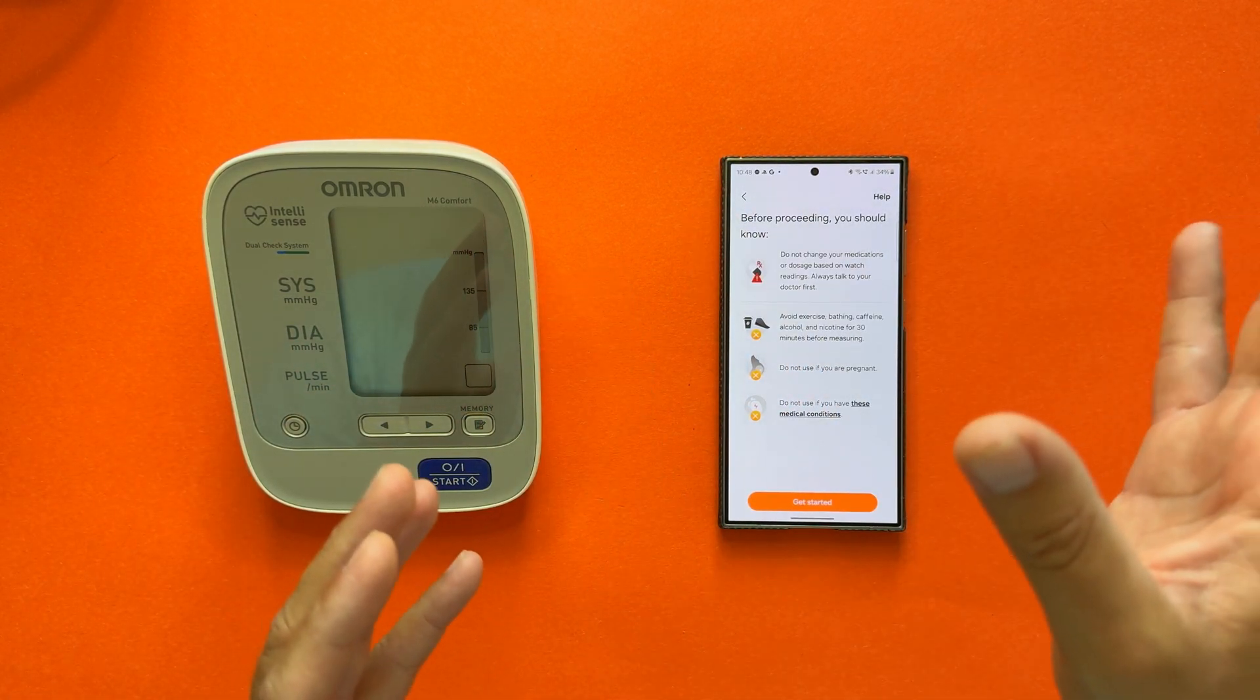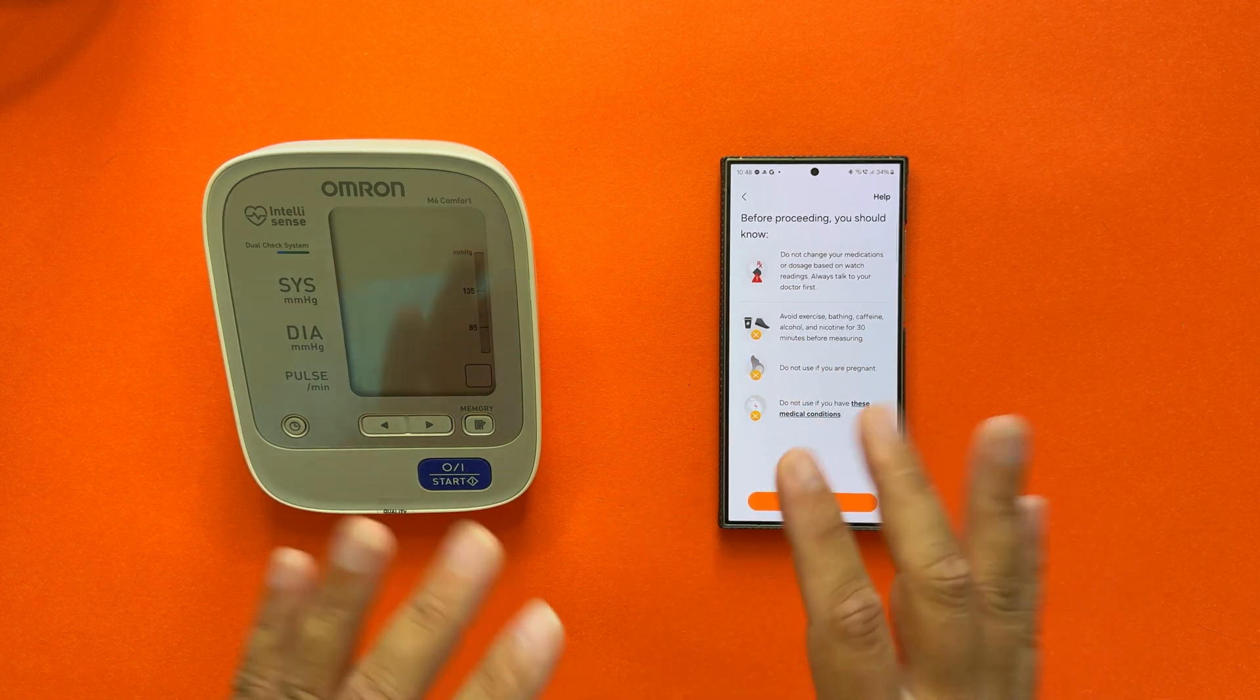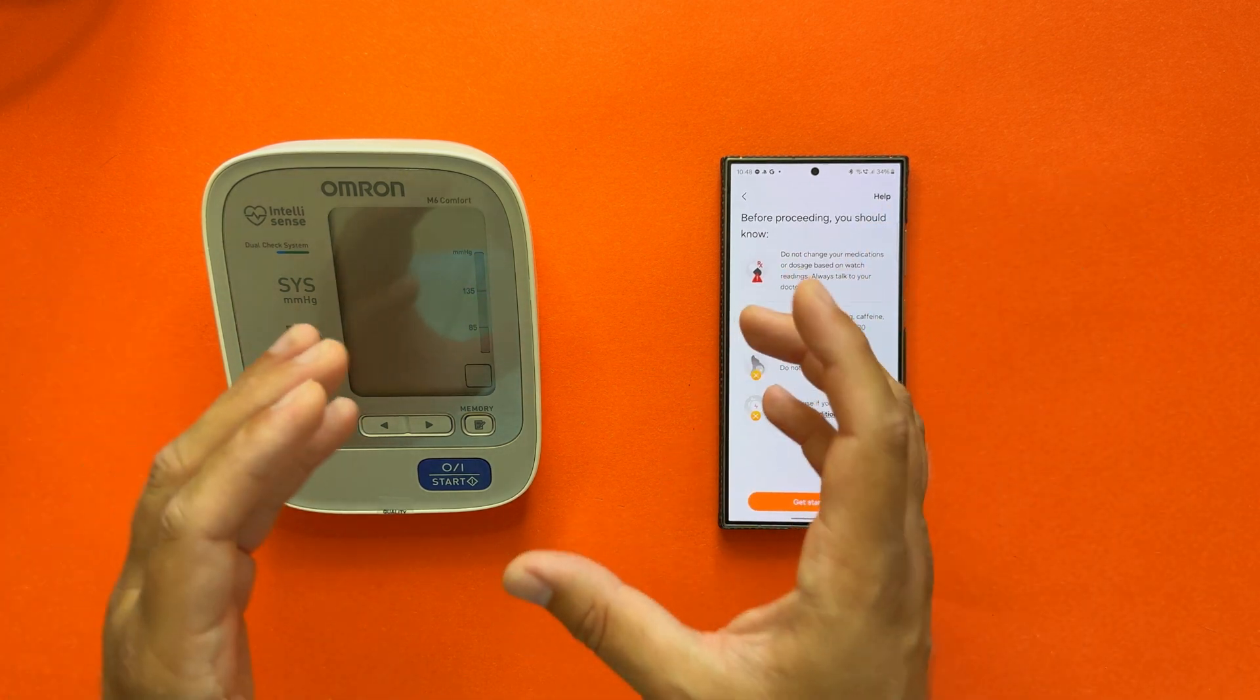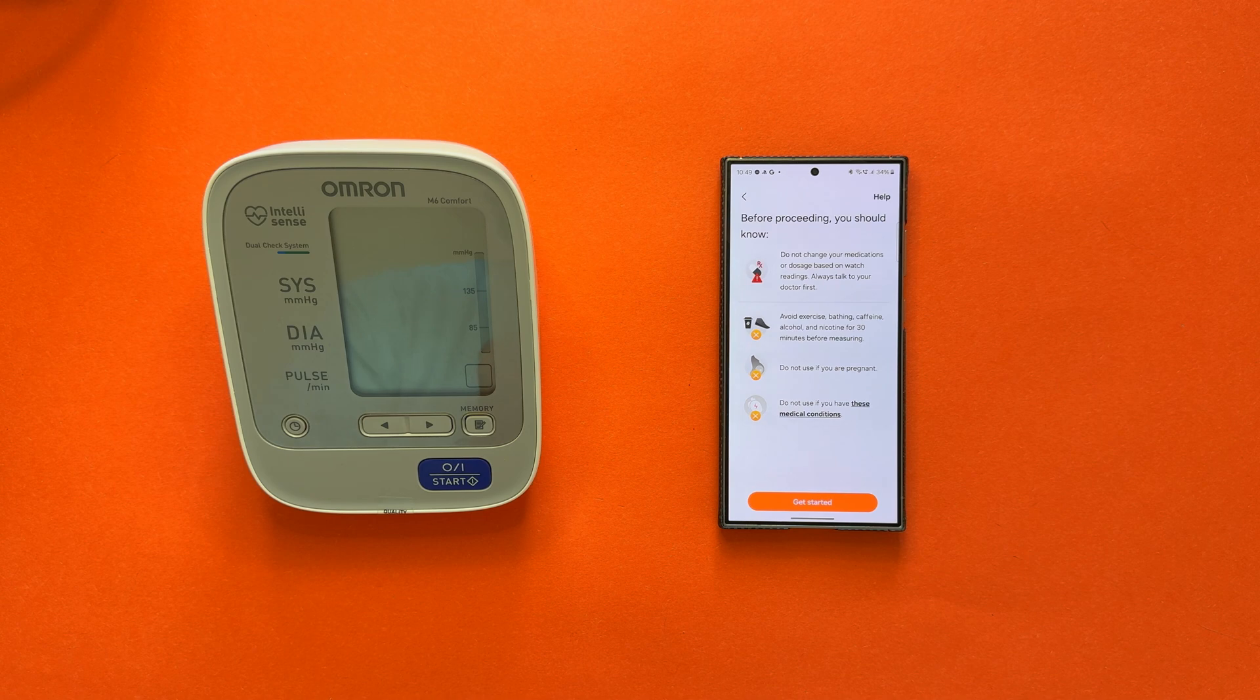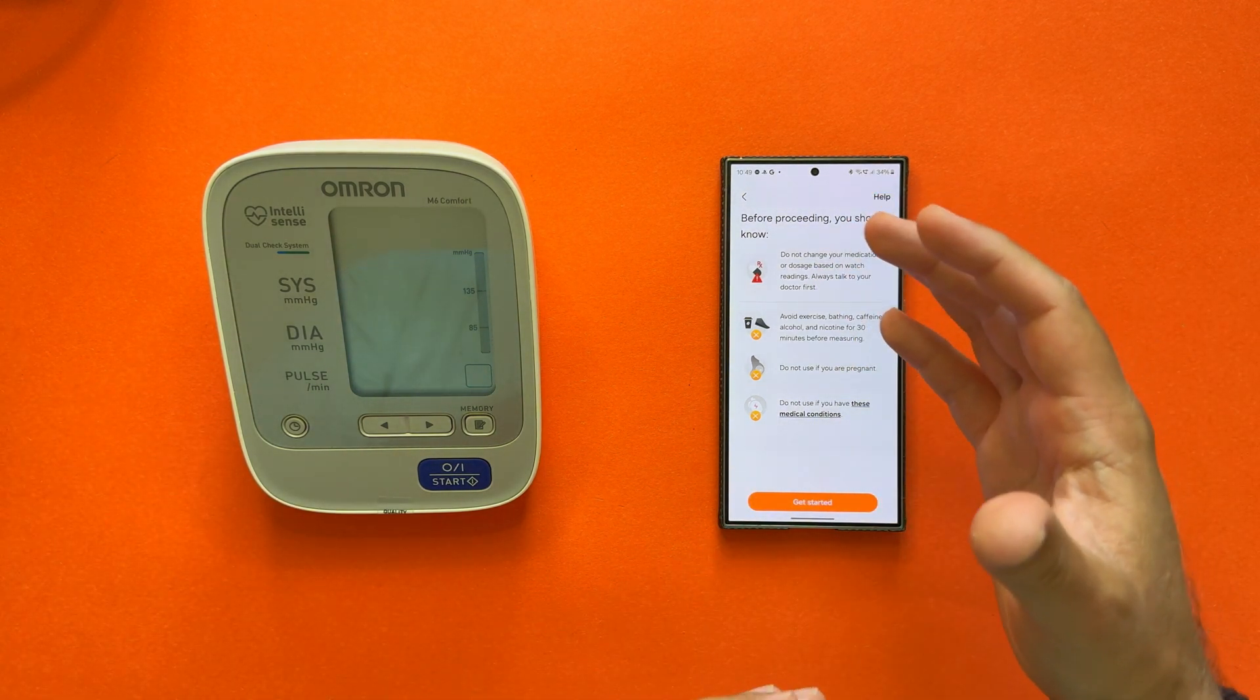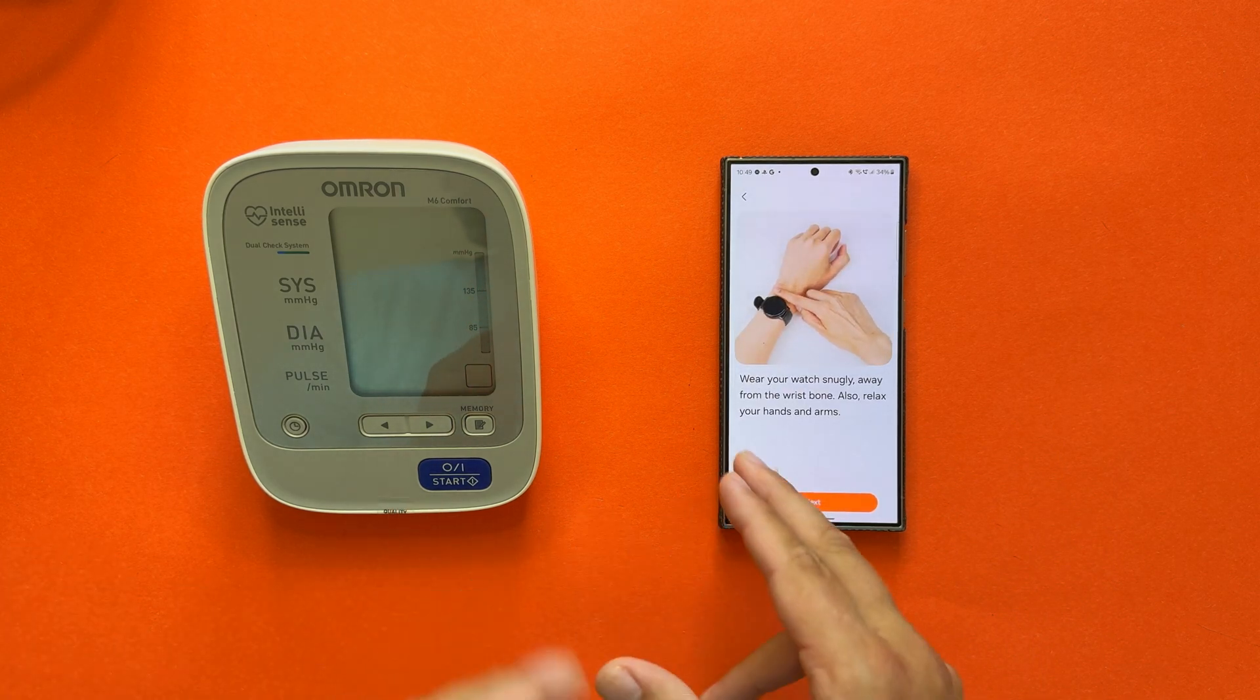Avoid exercise, bathing, caffeine, alcohol, and nicotine for 30 minutes. Now this is something that I did not do, but anyway I'm just doing this video to show you how you can calibrate your Galaxy Watch Ultra if you have this blood pressure monitor. Do not use if you're pregnant, and there are medical conditions that are described here.